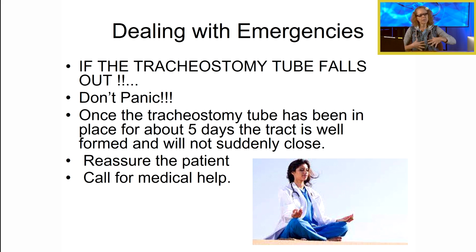So even though you might feel very anxious inside if something goes wrong with the trach, please try to stay calm and know this. Once the tracheostomy tube has been in place for about 5 days, the tract is pretty well formed, okay? And it should not suddenly close on you.